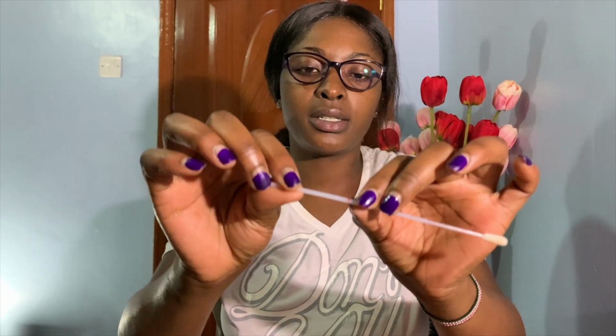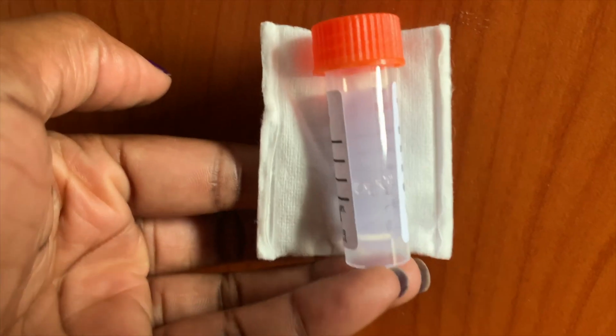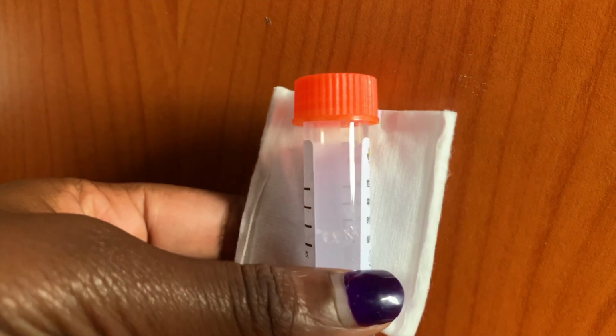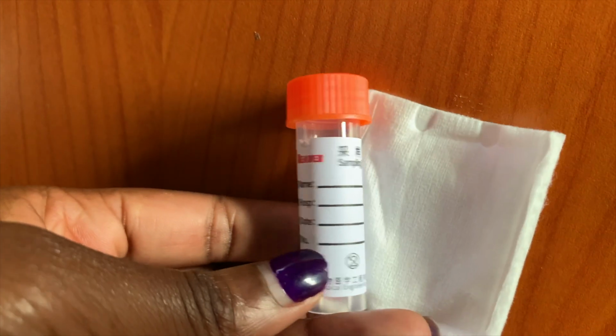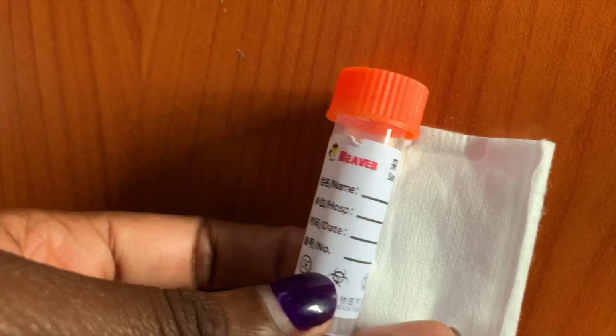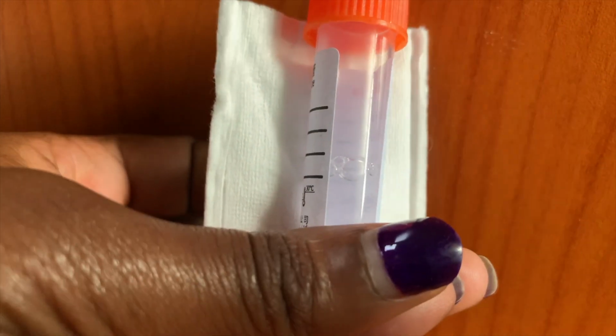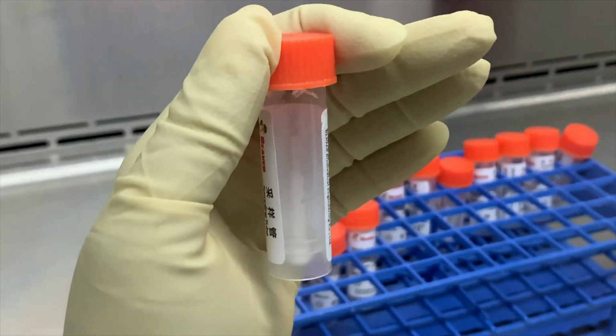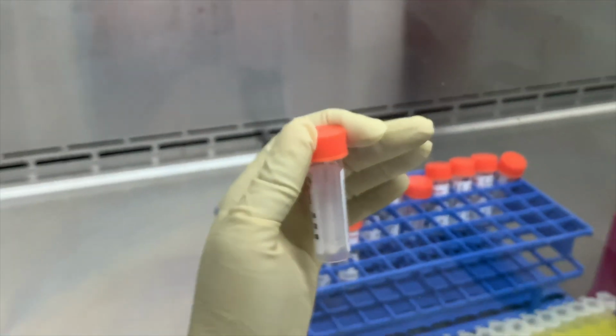After that is collected, usually they will cut. They will have to break off some part, and whatever remains, they put inside a small tube. Usually this tube contains something called the VTM, a viral transport media. Once you cut off this swab, you put it inside and close it properly.